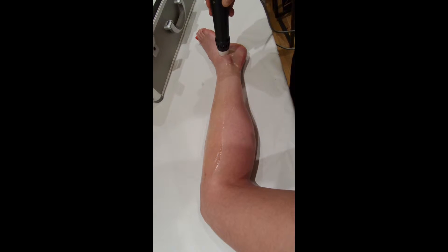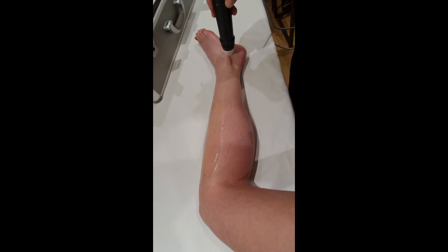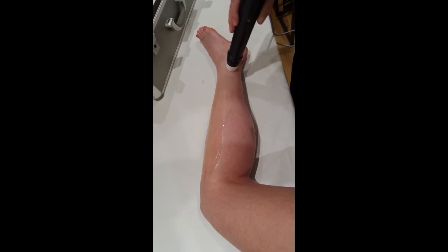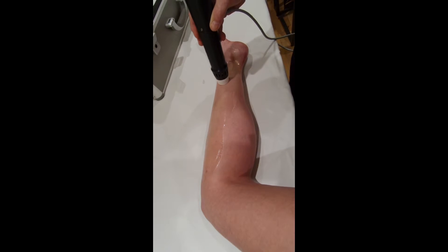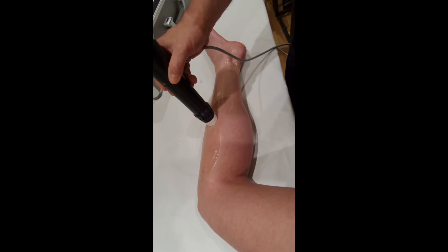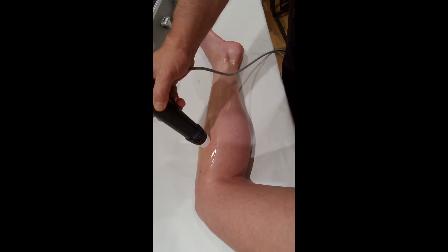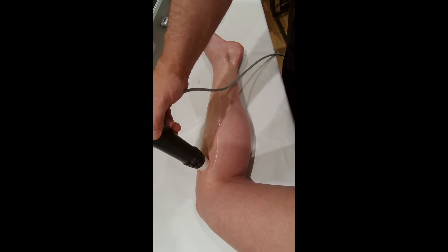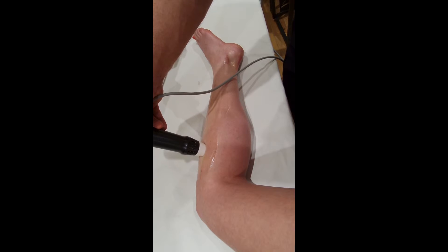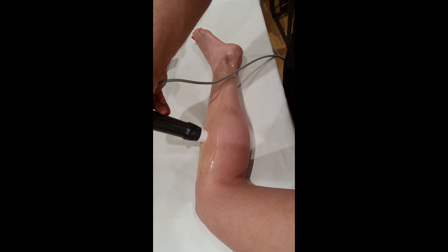I've seen people press into the shoulder extremely hard as if it would get deeper into the muscle — it won't. Depending on your settings, it depends on how deep into the muscle it actually goes. Obviously the larger the head you have, the more dissipated the energy will be, and so the less distance into the body you're going to reach at the same setting, although you can just keep turning the machine up to reach the right level.